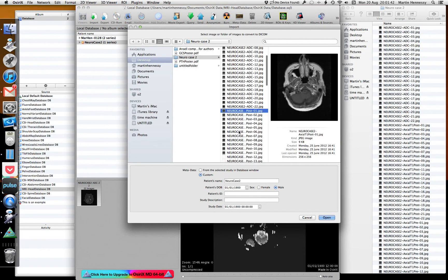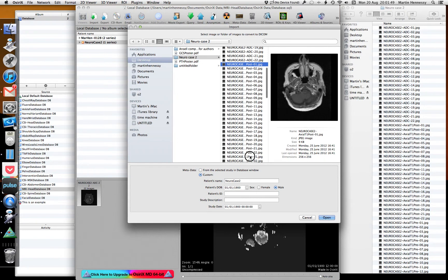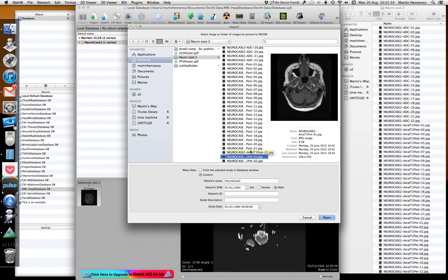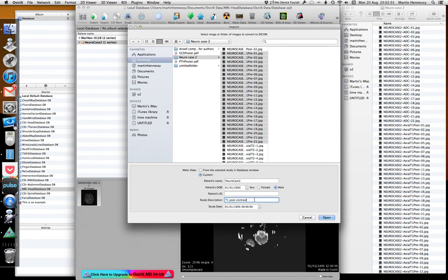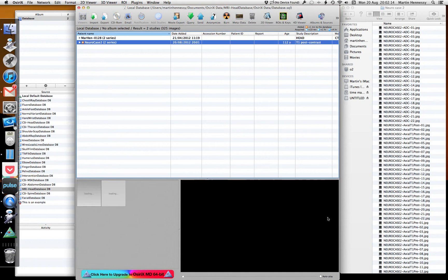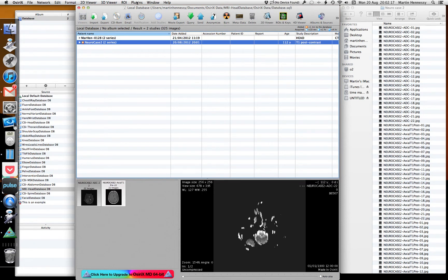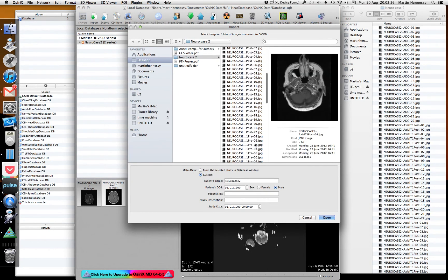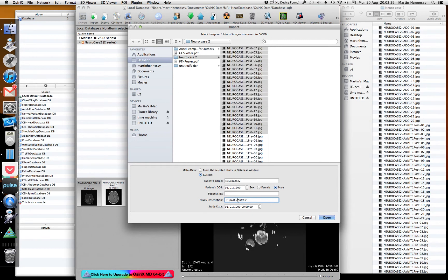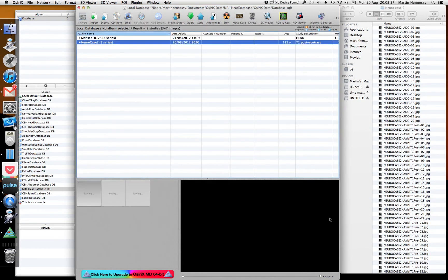I'll repeat the import for the remaining series. The post-contrast has appeared before the pre-contrast for alphabetical reasons, but OsiriX will order them in the order you drag them in, so I'll do pre-contrast first. Because they've got the same patient name, they've popped up in the same patient file. T1 pre and post, same patient name — make sure the description matches.